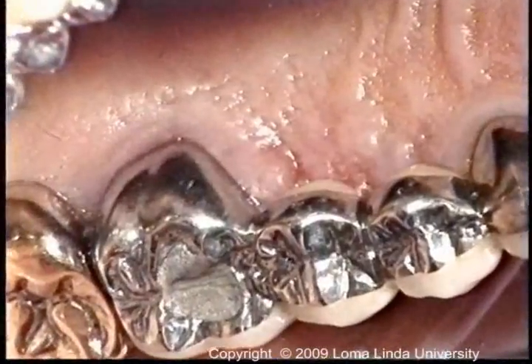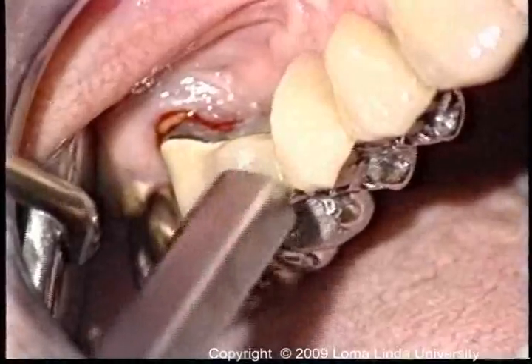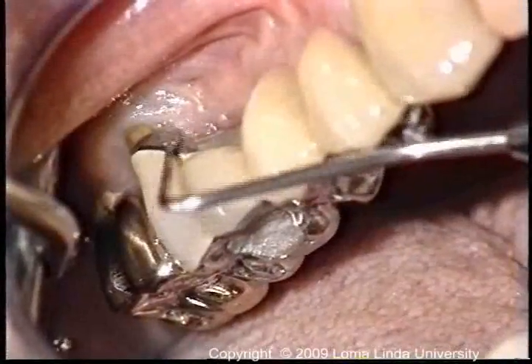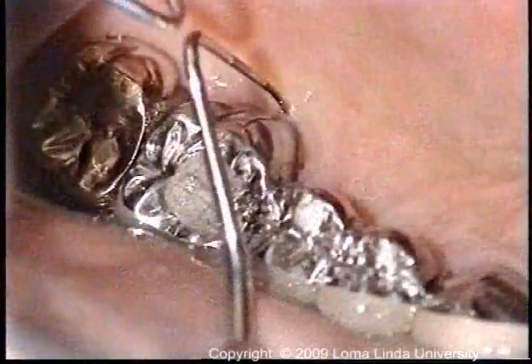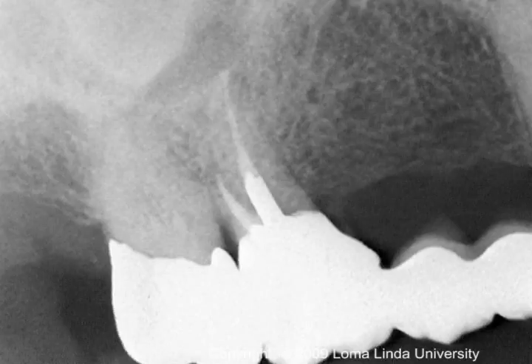Examination of the patient 1 year later revealed excellent gingival healing. There was no pain to percussion. Probing revealed minimal pocket depth along the buccal and palatal aspects. The 1 year post-operative surgical procedure radiograph shows a complete return of the normal periapical and lateral root architecture.